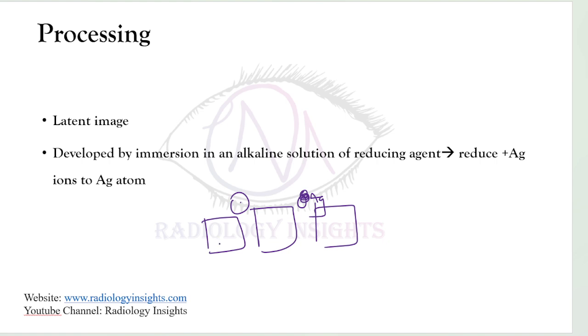A layer of bromine ions forming the surface of the crystal repel the electron donors, or the developer molecule, and allow their entry only at the latent images where the ion barrier is breached. However, given sufficient time, the developer would penetrate the unexposed crystals.